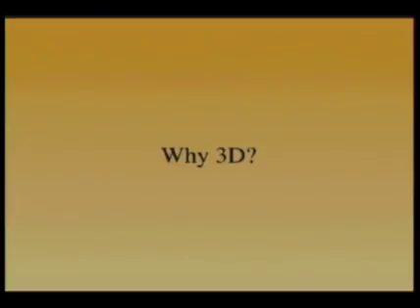One of the questions to answer as you approach the concept of doing 3D in the abdomen is why do it to begin with?